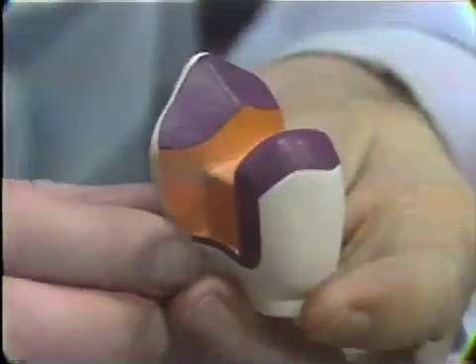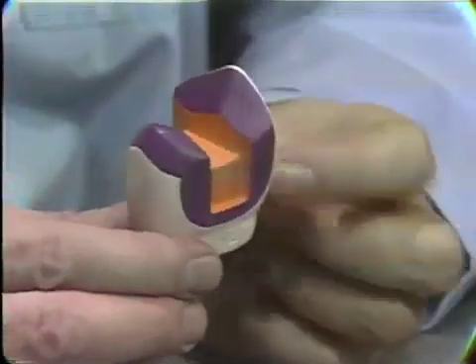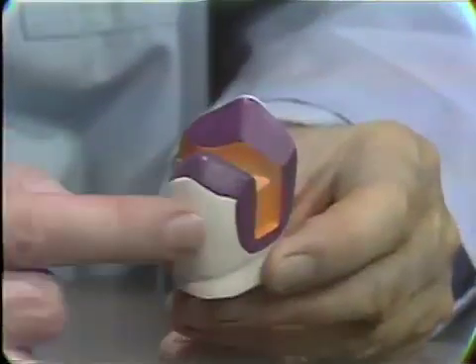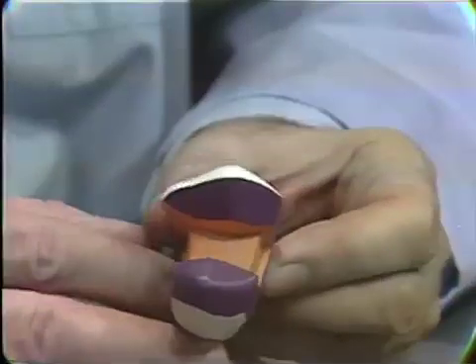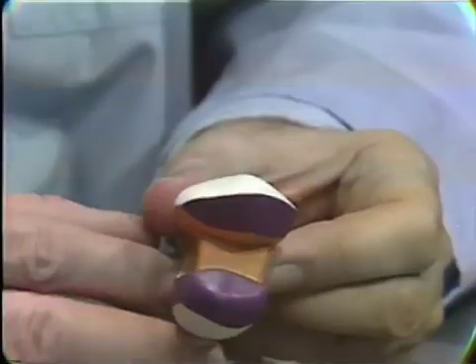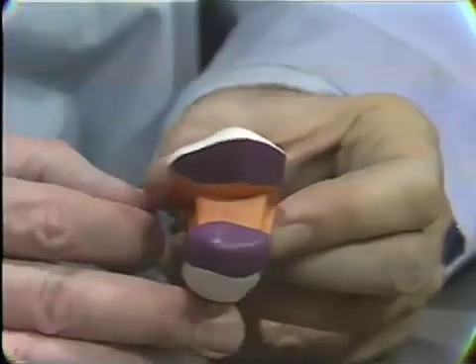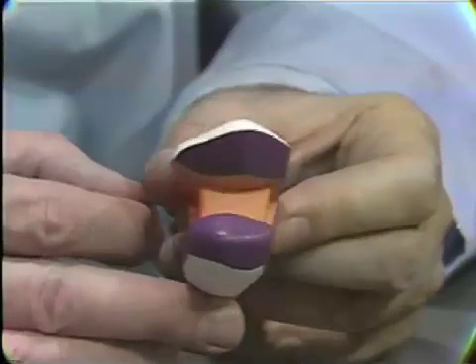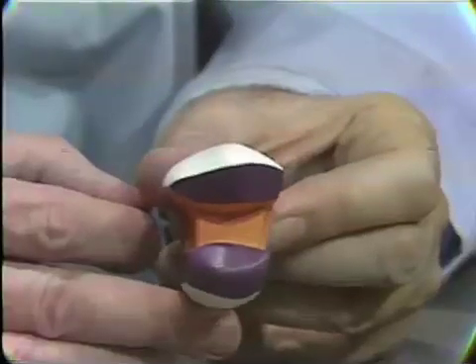So in a way this is almost like one of the three-quarter crowns that we looked at, except that the lingual surface of the lingual cusp is not cut away and protected. And this then is something that you would use in a tooth that had previous restorations, an MO, a DO, or an MOD amalgam or inlay. This would be the means of converting it to a bridge retainer with minimum extra cutting of the tooth substance.